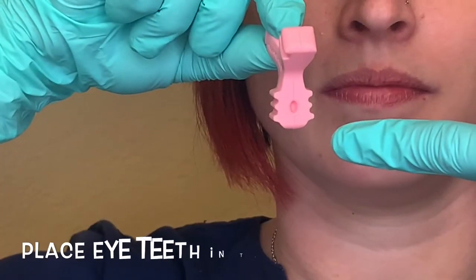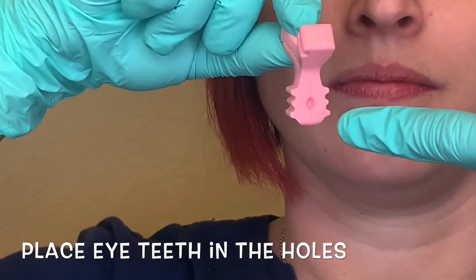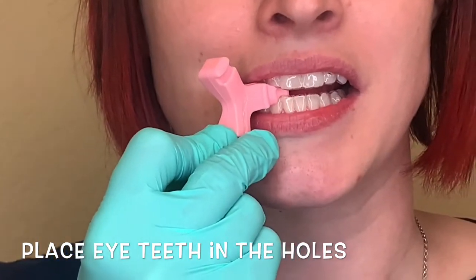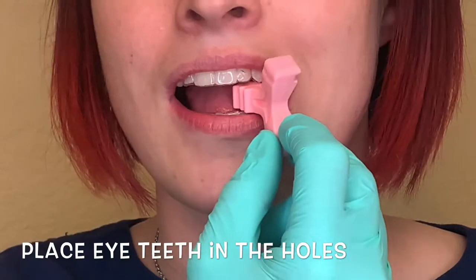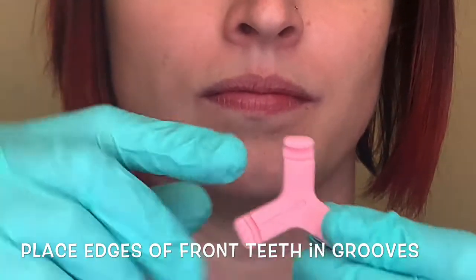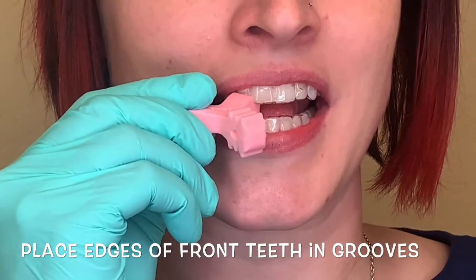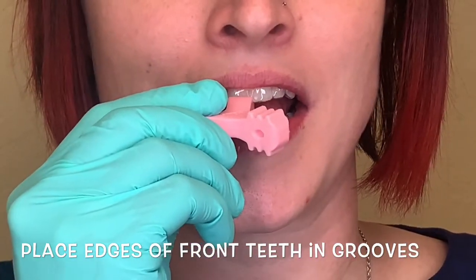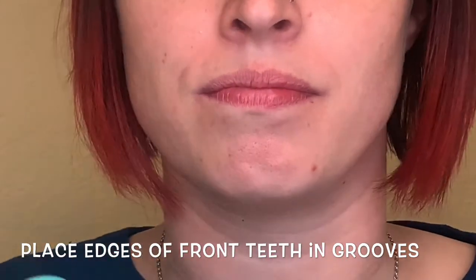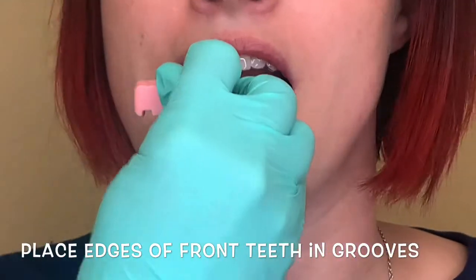Next, you're going to turn your munchie sideways and seat the eye teeth with this. Then use the larger groove to seat the top teeth, and then flip it around to the smaller groove to seat the bottom teeth.